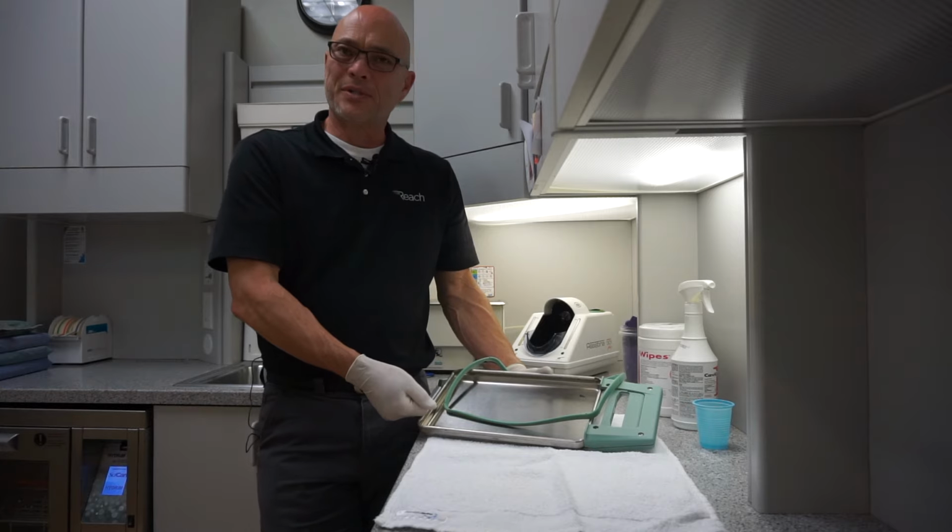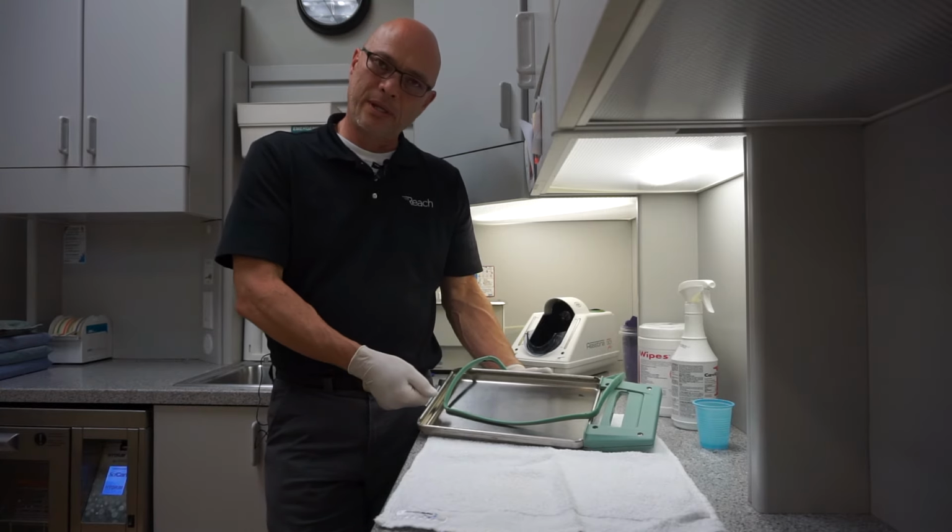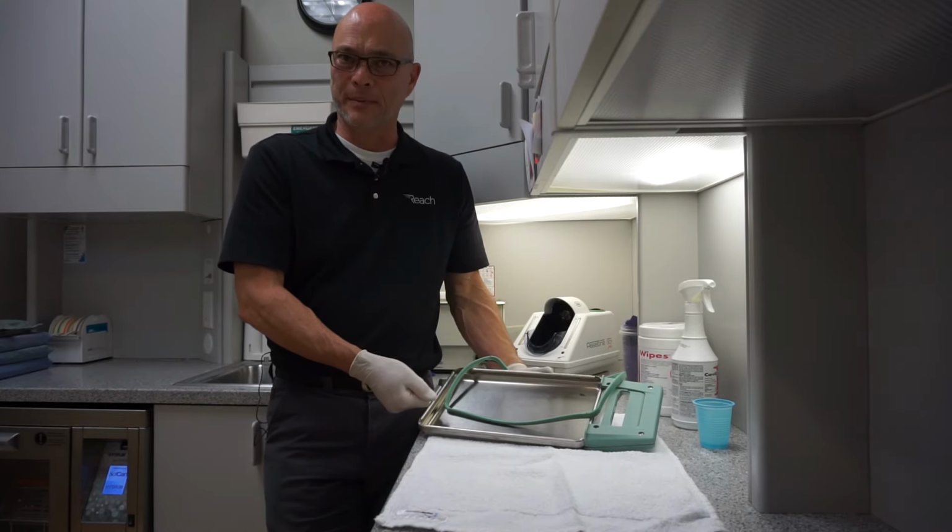Welcome to Reach Tips. Today's topic is going to be the Statim gasket replacement.